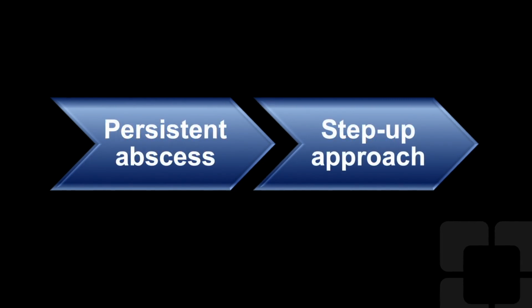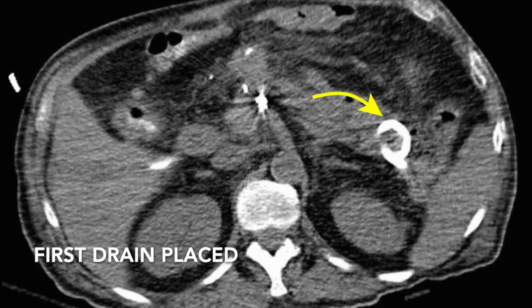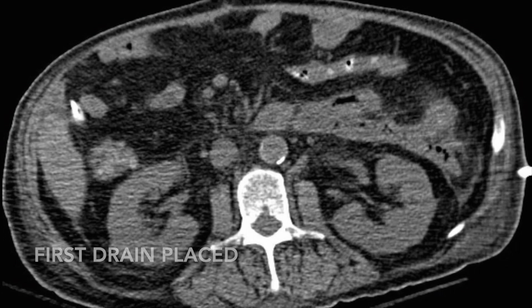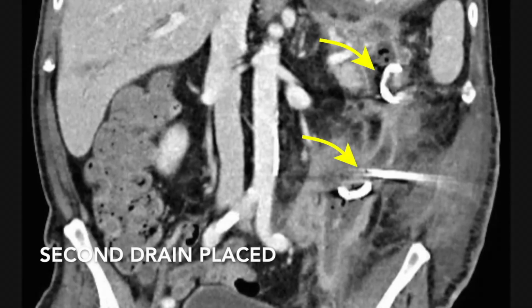After a multidisciplinary discussion, the patient was given neoadjuvant radiation, which also allowed a window period for the resolution of pancreatic necrosis. A Whipple was performed 4 months after the onset of pancreatitis. Pathology confirmed it as a T2N0 tumor. The patient had a persistent retroperitoneal abscess after surgery, for which the step-up approach was employed.